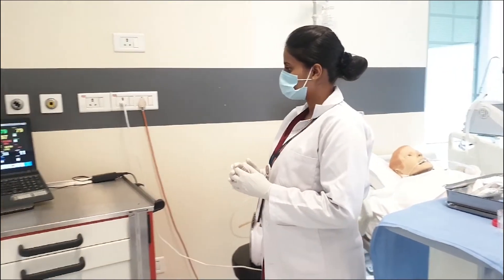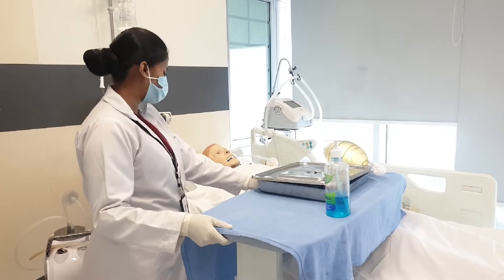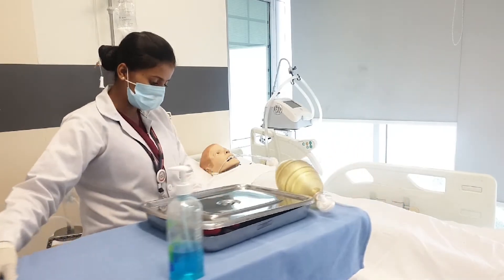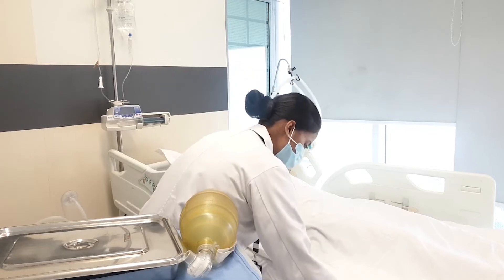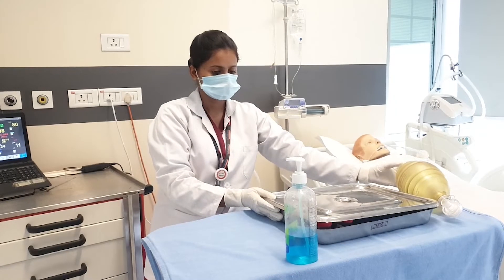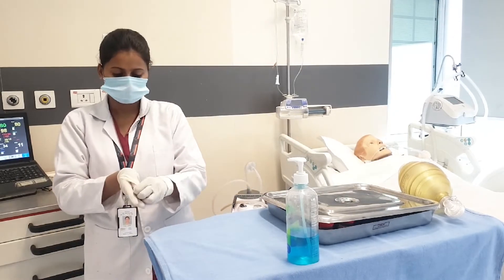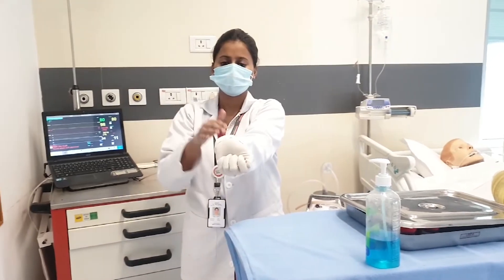Monitor the post-procedure vital signs. Okay sir, I am done with the suction procedure. I hope you are feeling well now. Thank you so much sir. Discard the waste according to biomedical waste policy and replace the articles.